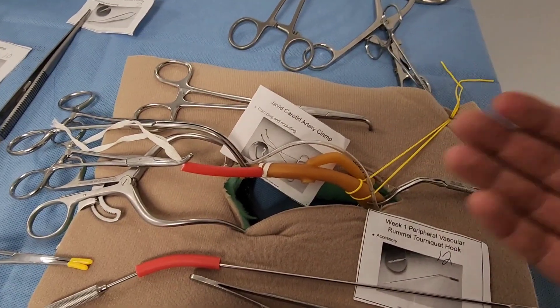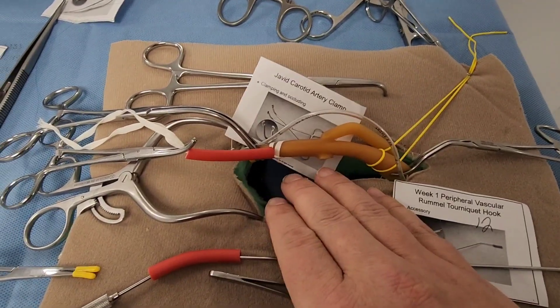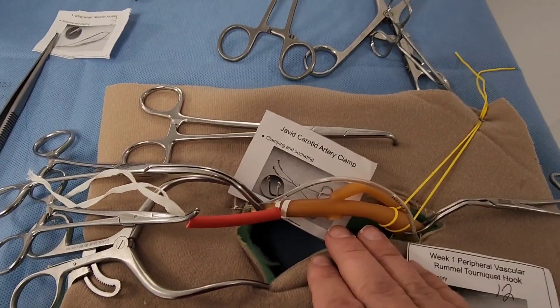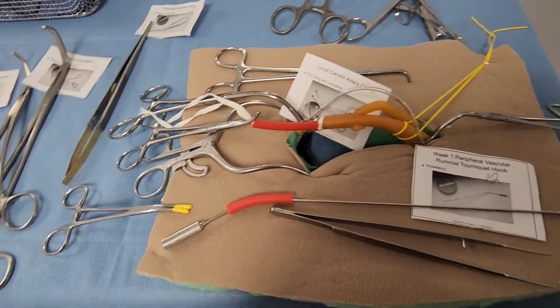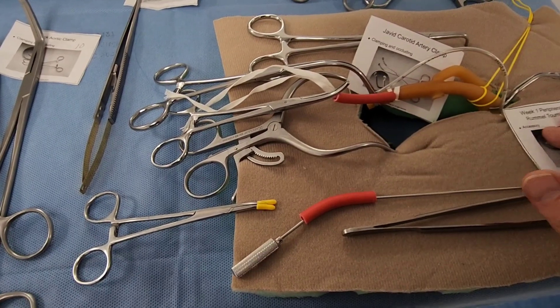Vessel loops can also be used in any kind of small vessel to control blood flow during a case. This applies to cut-down procedures — where you make an incision to isolate the artery — as opposed to a percutaneous approach.